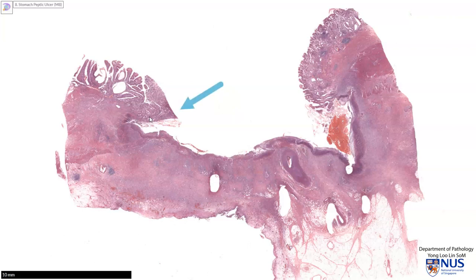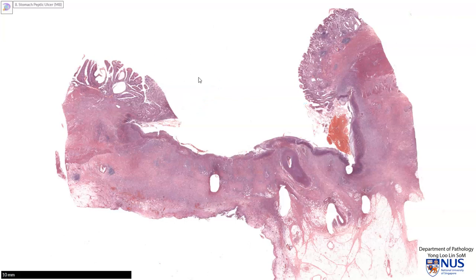The ulcer edges, as I am pointing to on the left and on the right, are straight and punched out. They are not heaped up or rolling. If they are heaped up, we will worry about a cancer that has ulcerated. But with this punched out appearance, which we will see later on grossly, we are more reassured that this is a benign ulcer.